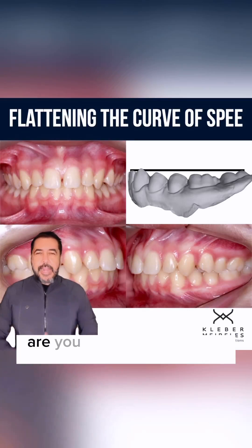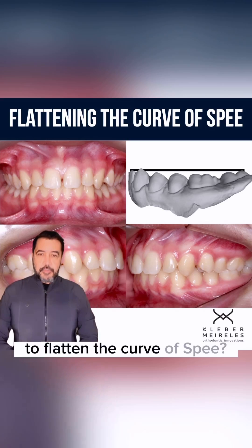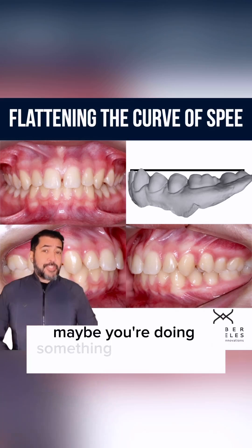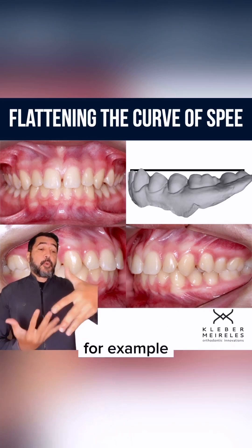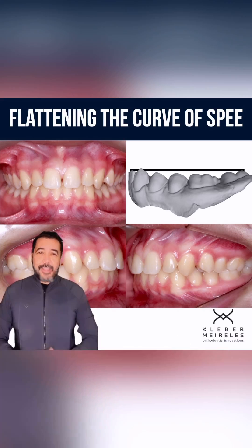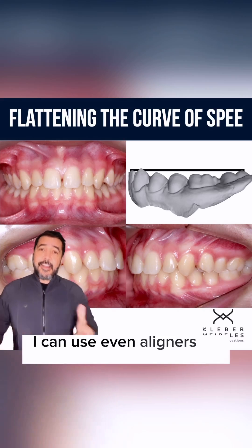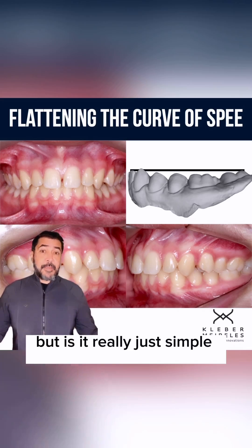I got a question for you. Are you taking more than two or three months to flatten the curve of Spee? Maybe you're doing something wrong. When you do this for correcting, for example, diastema in the anterior segment, it seems to be easy to do. I can use even aligners to do this — but is it really just that simple?